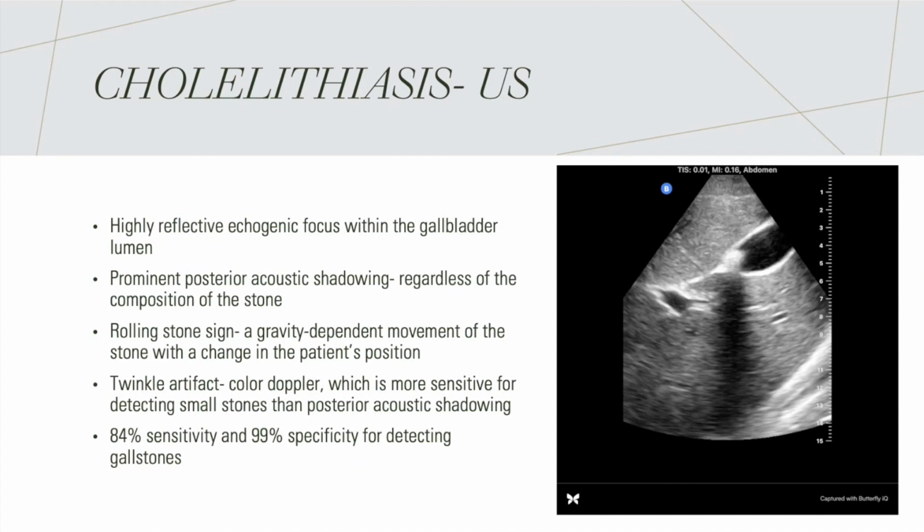You may also see something called a twinkle artifact. So for small stones, you can look at it with a color Doppler, and this may actually be more sensitive for detecting small stones than looking for that posterior acoustic shadowing. And like I said previously, ultrasound is 84% sensitive and 99% specific for detecting gallstones.